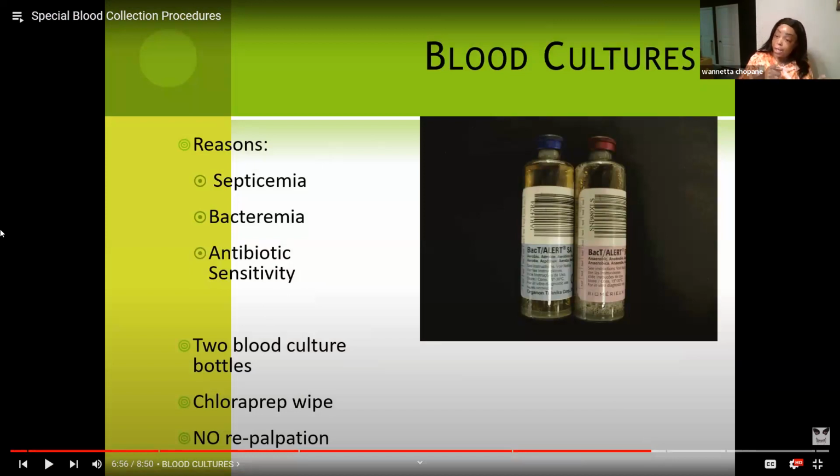He did mention, though, if you do draw blood on a pediatric patient, they only get 1 bottle, and a pediatric bottle would be a pink top, but similar to the pink color of our blood tube. Okay, you will just grab that pediatric top and you draw your infant. But for the most part, you will have your two bottles for your adults.